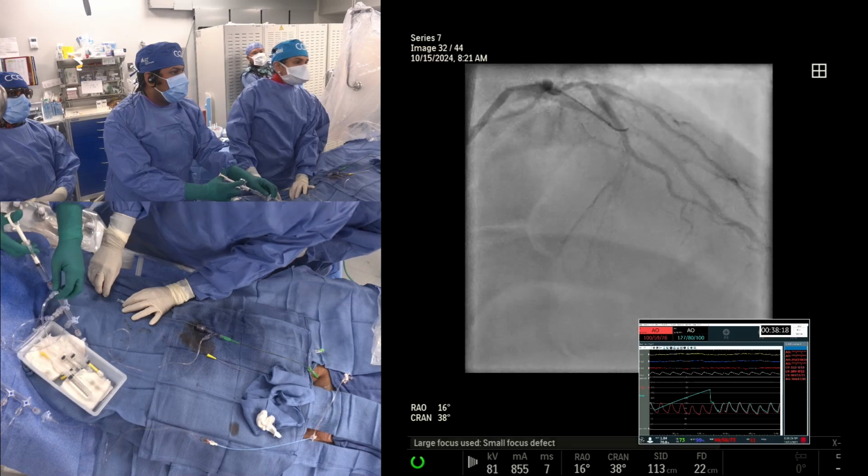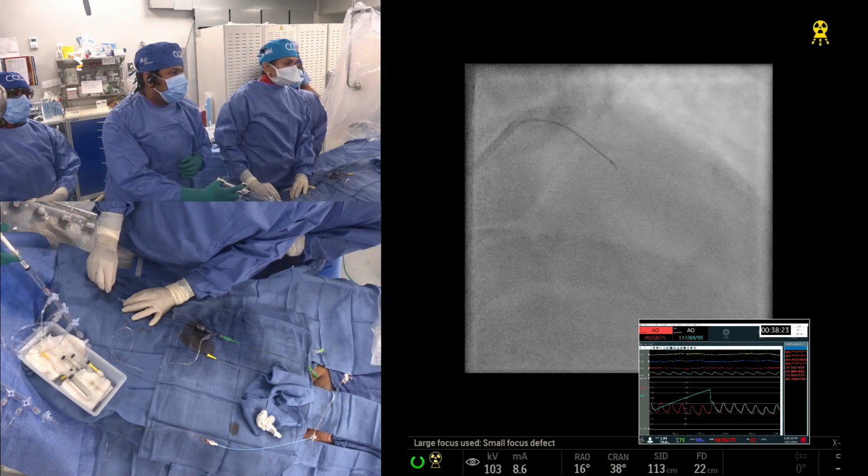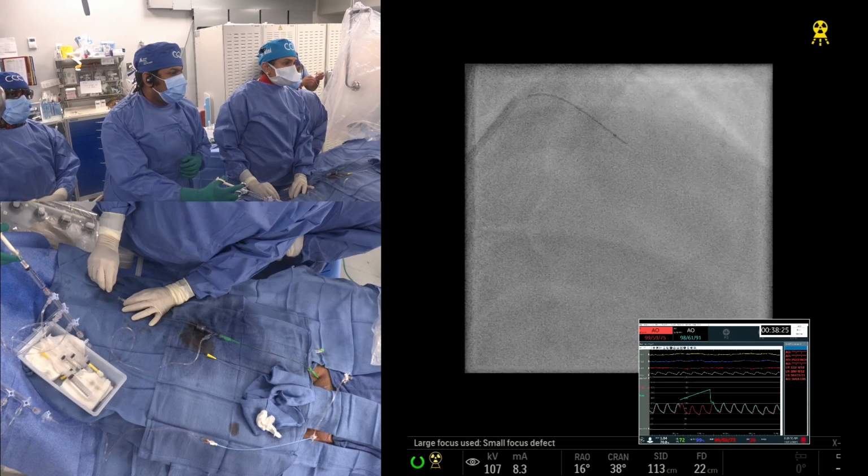Exactly what we thought going into the diagnosis. So, suggestion of an ambiguous cap. Yeah, definitely.